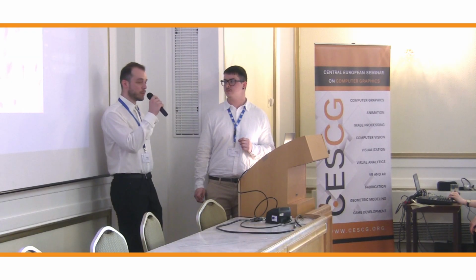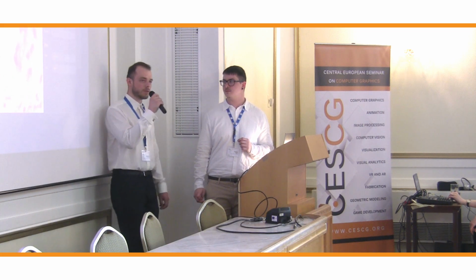I just wanted to ask how you implemented the segment anything model. Is it running locally, or do you call an API? The segment anything model is deployed in our AI API. First, the user must select the bounding box where he wants to do predictions.